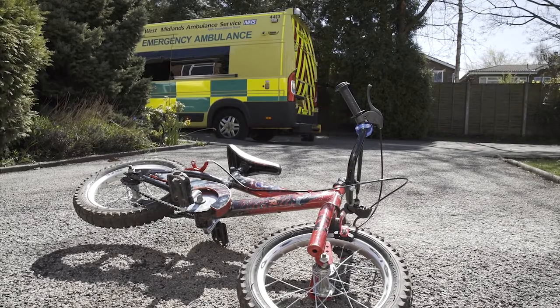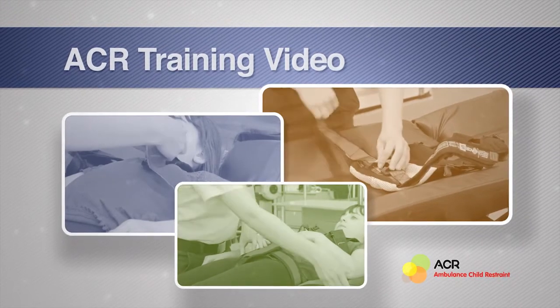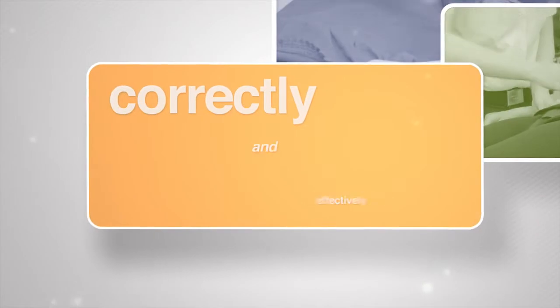I definitely recommend using the ACR to all clinicians — it's the only way really that you should transport a child. This is an ambulance child restraint training video. Follow this simple guide to ensure you are using the ACR product correctly and effectively.